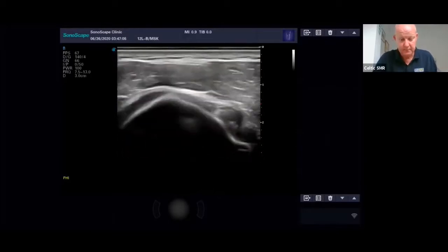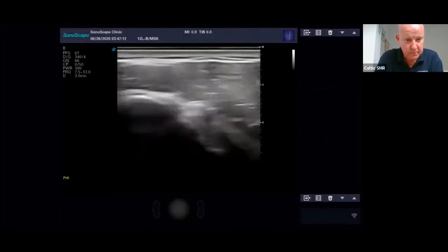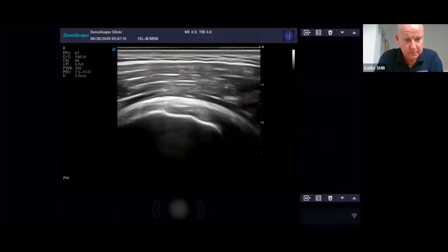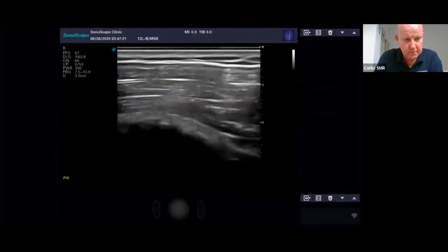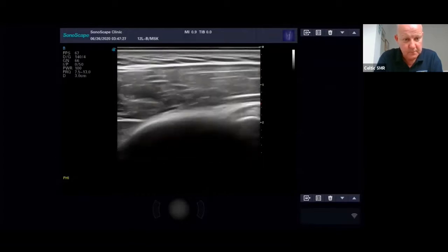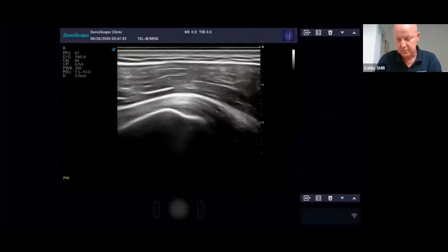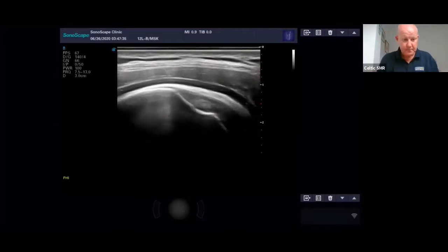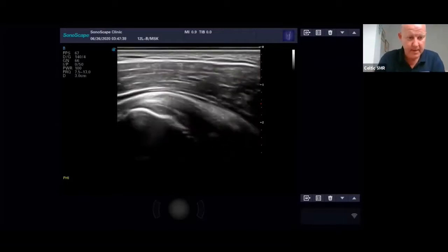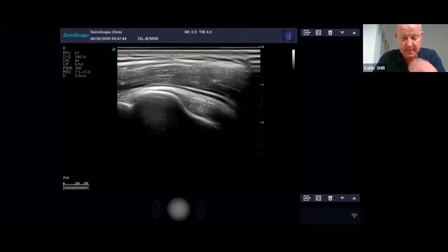We're going over the biceps tendon in a couple of weeks. So there's the biceps tendon. If I come back onto the supraspinatus, it's quite a common place, just by this anterior free edge area, to get tears. Just put your cursor there so they can see where. Just around here.